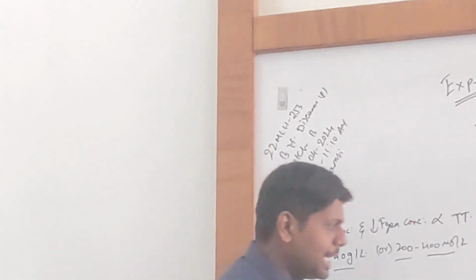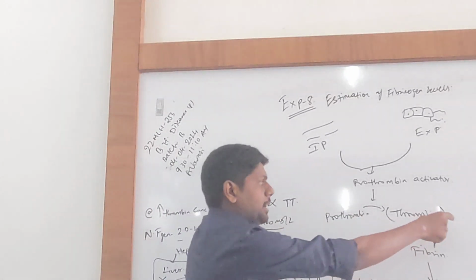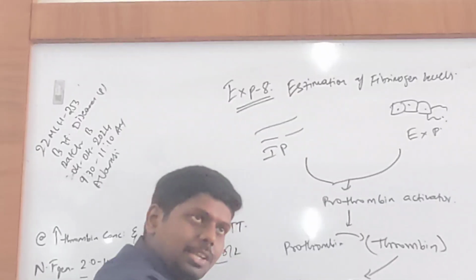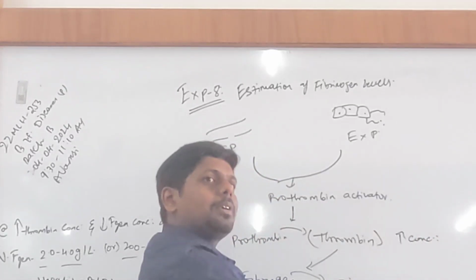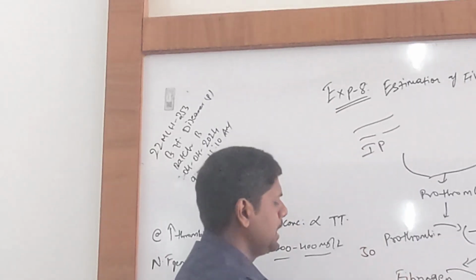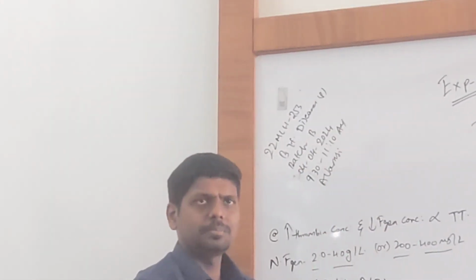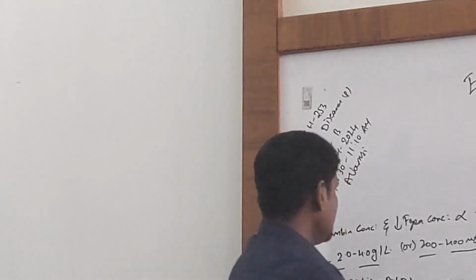Now the idea was reduced fibrinogen levels. At reduced levels, I have increased thrombin time. Automatically thrombin levels look increased. If you see the ratio, now that fibrinogen levels are reduced, it indicates thrombin levels might be increased, or they are normal but the ratio is altered. I will give one example. The ratio was 50:50. Since fibrinogen is reduced, it looks like 10:50. It looks like thrombin was increased. Got my point? Okay, so that is the idea.